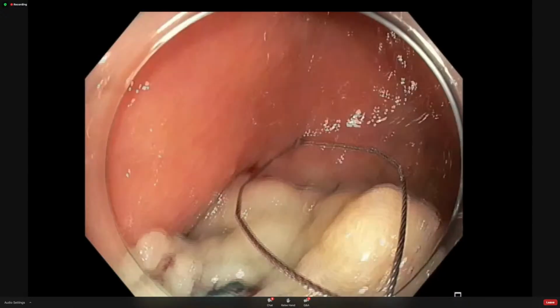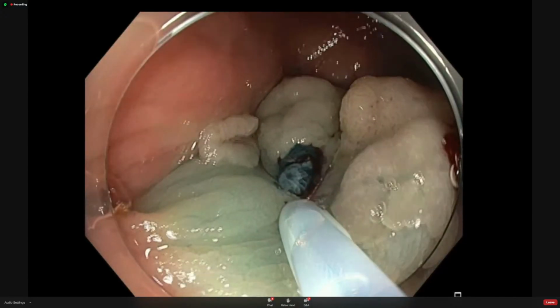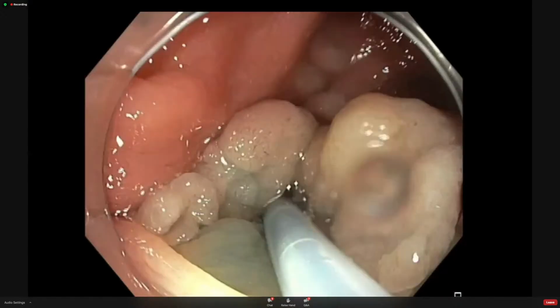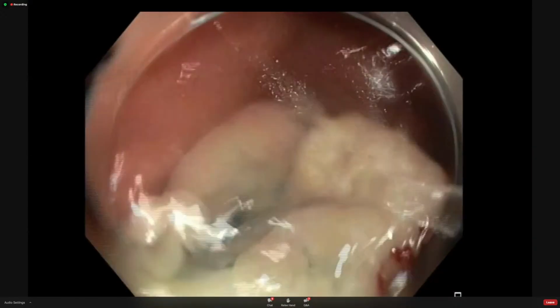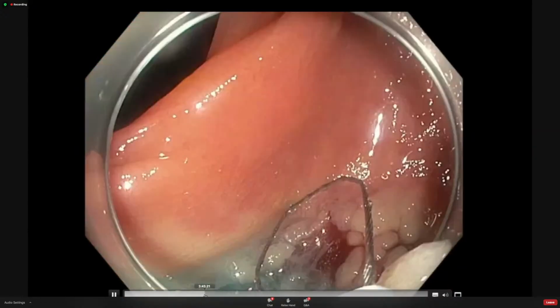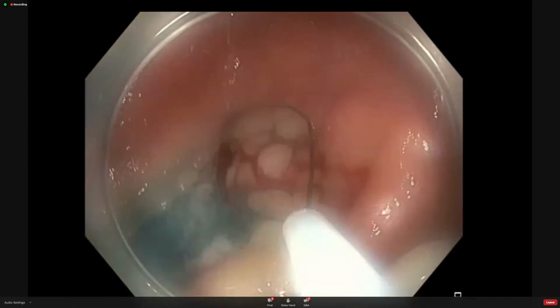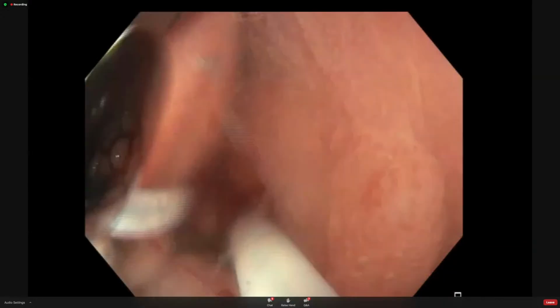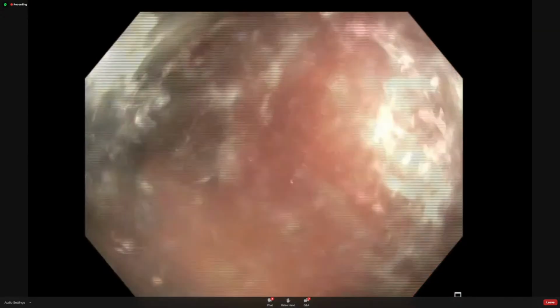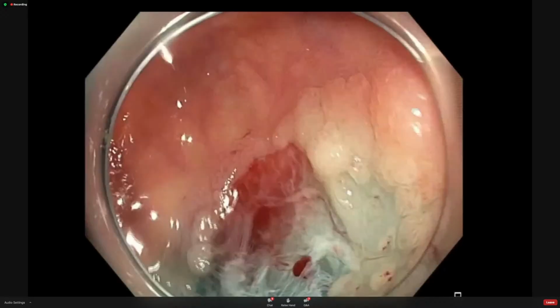Now again, this lesion is not a malignant lesion. All we need to do is to get underneath the polyp to cut it in a sequential manner. And the resection can be done fairly quickly and swiftly. This whole resection probably took a few minutes to do. Now you can see that as we are moving towards one edge to the other, we're just gonna cut in small pieces, and obviously the lesion is gonna move away towards the most dependent or gravitational area.